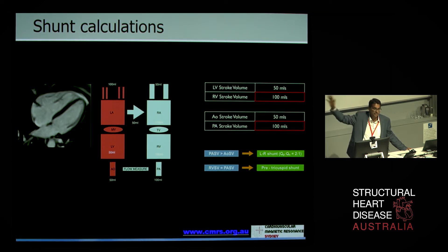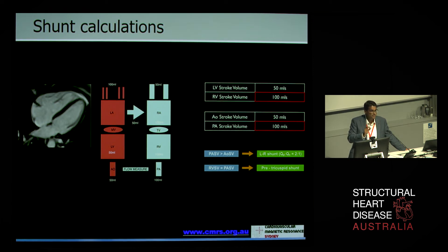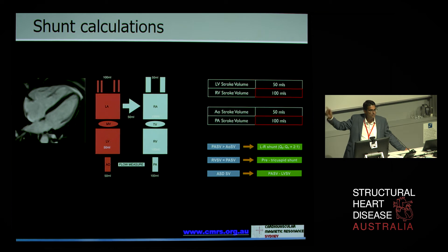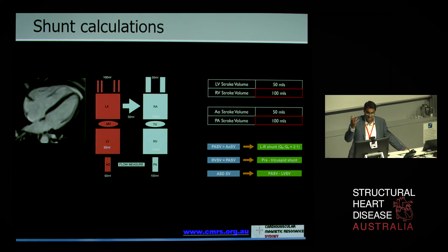So I already know, once I've contoured these — which we often do on the fly — that we're looking for something at the atrial level or above. I know from the echo data that this was a small hole, and the size of the hole won't necessarily tell me exactly how big the shunt is. The ASD volume is the difference between what the pulmonary artery sees and what the left ventricle has, because that's where the flow has been stolen from. The extra 50 mils should have ended up in the left ventricle but went across — so the difference between the LV 50 mils and the PA 100 mils is the ASD volume of 50 mils. We can be very quantitative about how much flow.